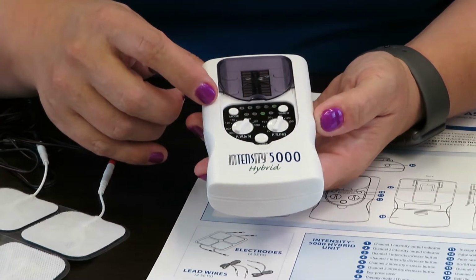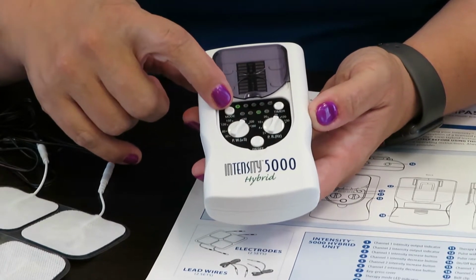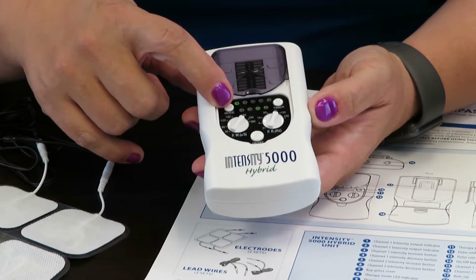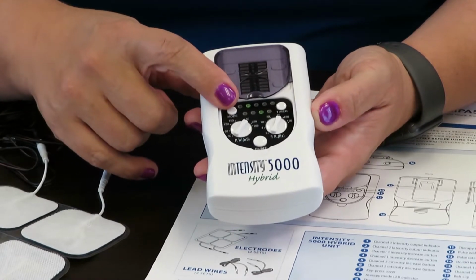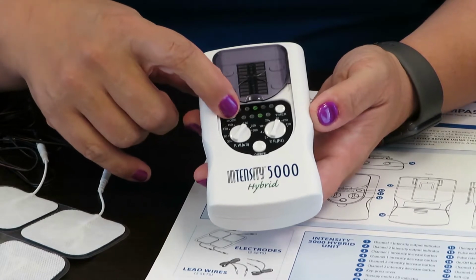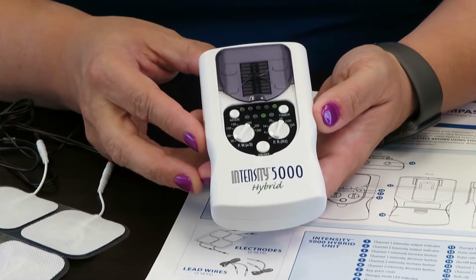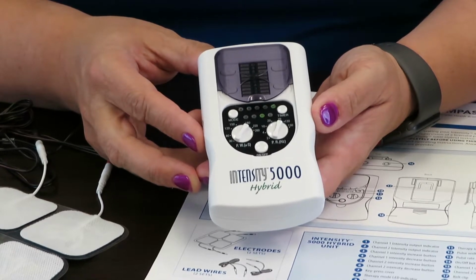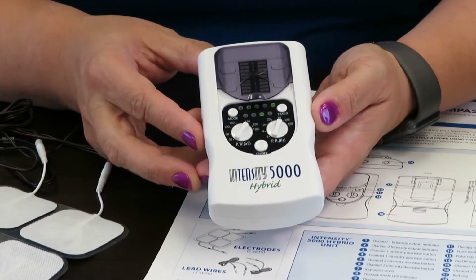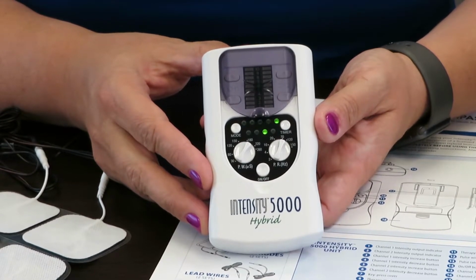The first one is burst, and you select that here by pressing the mode button. The second one is normal, then pulse width modulation, pulse rate modulation, strength duration. I suggest starting out with normal, then testing it out with the other modes to see what works best for you. You can also manually adjust the pulse width and pulse rate with these knobs here.